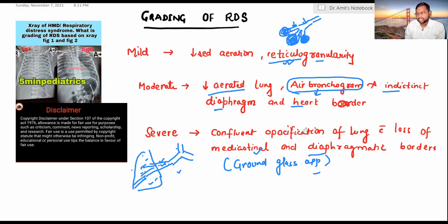You have to understand the meaning of reticulogranularity pattern. Here in this section you can see the reticulogranularity pattern and air bronchogram. Here we have almost indistinct diaphragm and heart border. This is about RDS. You can easily assess the severity of the disease on the basis of X-ray and give surfactant to this child accordingly.